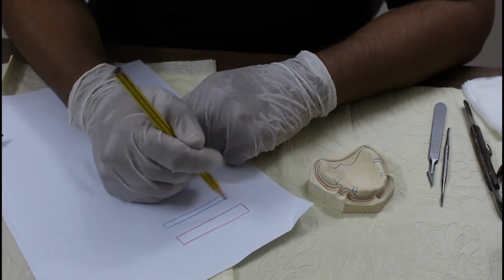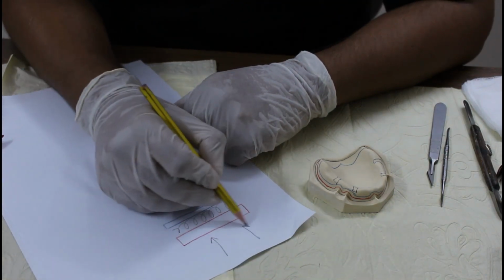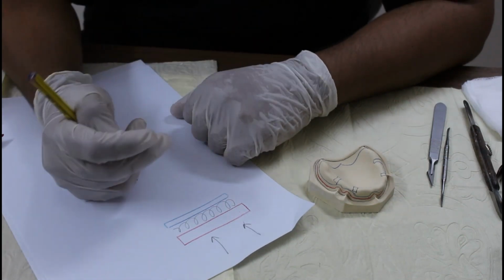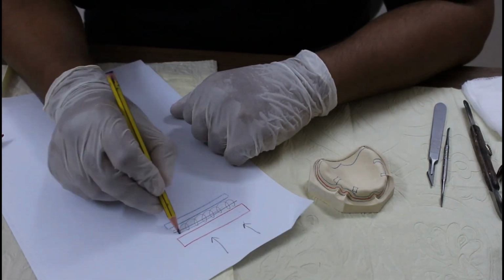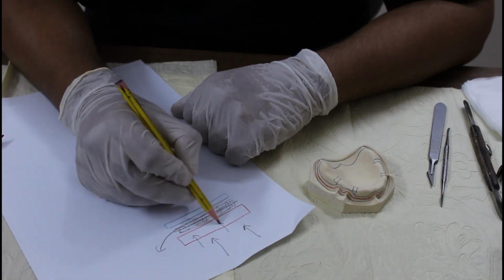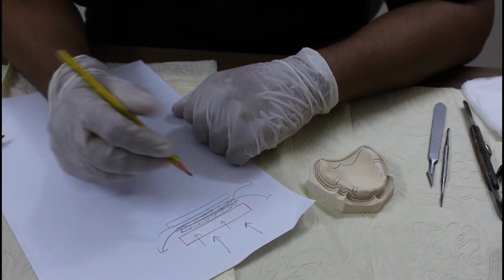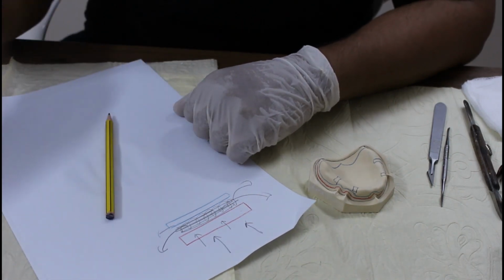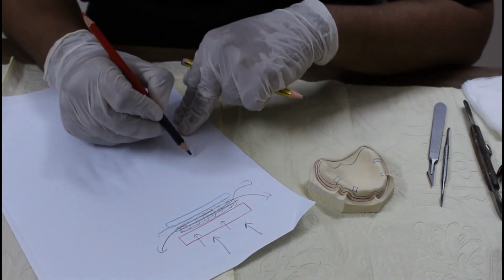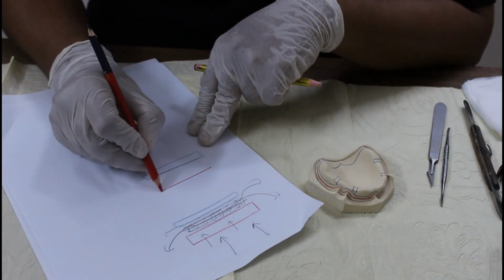We are going to put impression material here, and then we will apply pressure when we are making the impression. Now impression material is soft. When we apply pressure down on the tray, all the material will come out. So what we do, we put stops.